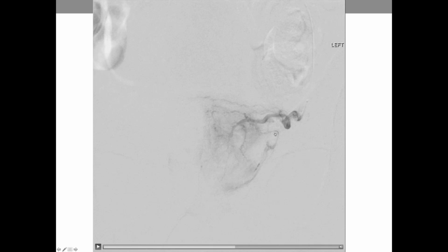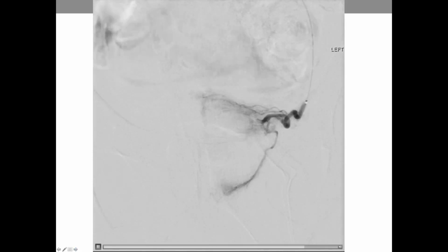And so when we got down there with the catheter, this is what we saw. We saw the left hemiprostate and then this big vessel right here that's coming through. And we're not even seeing the continuation of it because there's flow coming upward. Now this is with the balloon down. And then the same angiogram with the balloon up looks like this. Now we're seeing even less of this because we've created this low pressure area here distal to the balloon, and now the flow coming upward is even more robust than it was before because of this low pressure area.